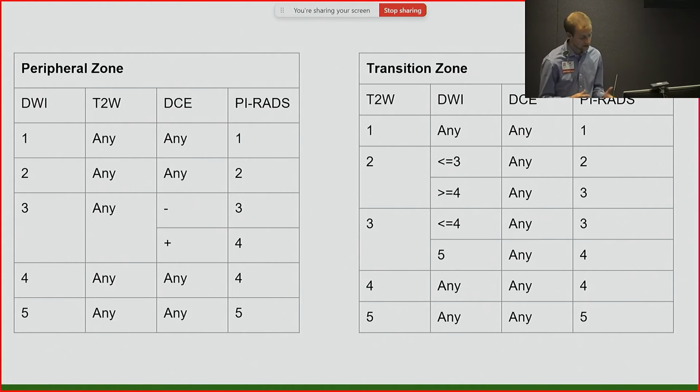I think, again, if you read through the reports here, it's really nice, not only on the image side of things, but on the report side of things. It's really a pretty standardized template where if you look through a lot of these scans, all the radiologists pretty much put stuff in the same order. They're going to start with the size, the shape, what was their recent PSA, then they'll talk about the lesions, what do they look like on these various phases. And so it's nice that you can pretty much always know what to expect, and there's a lot of consistency amongst the providers here, which has been really helpful.